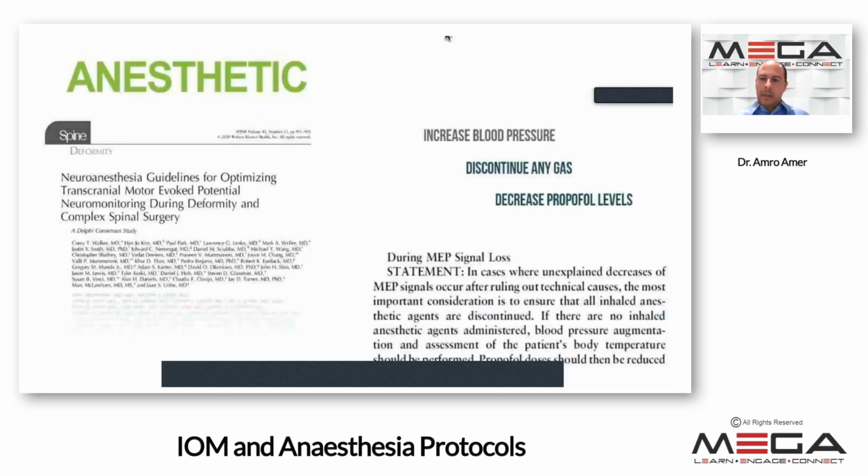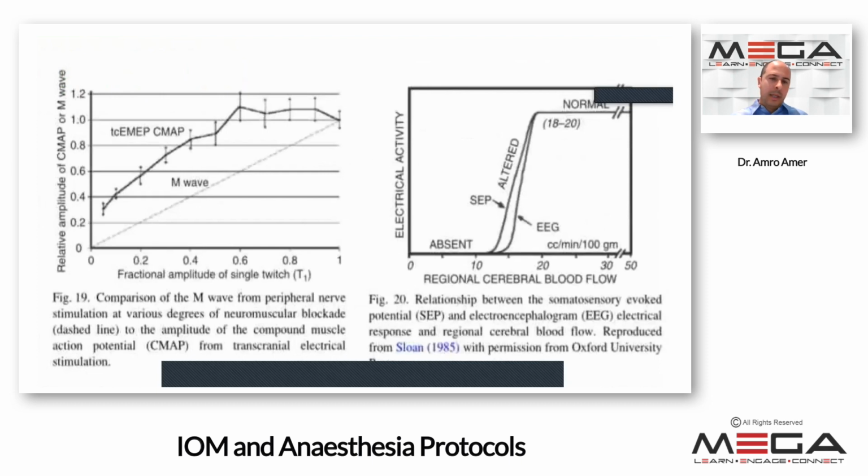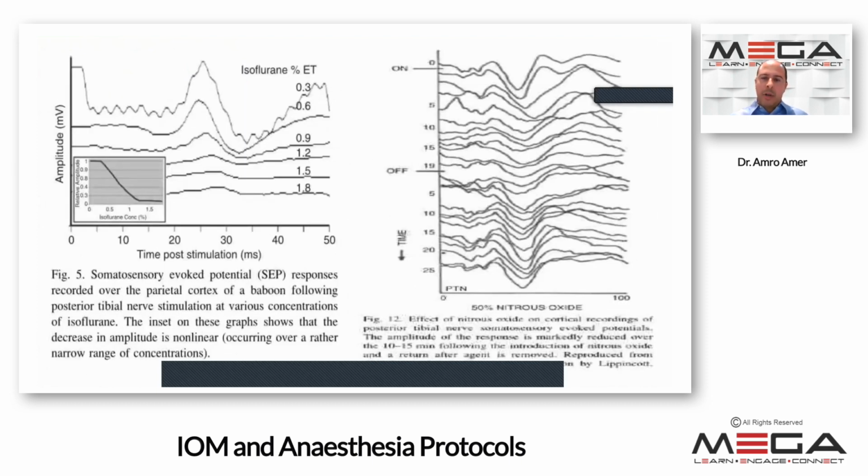Another study was done showing this. On the right side, you can see the nitrous. I didn't see that for a long time, actually. Nitrous effect on the sensory signal on the bottom of this line is almost increasing with the nitrous intensity. On the left, it's the same on the top. That's a baseline. The more we increase the MAC, the more obliteration we see in our signal.